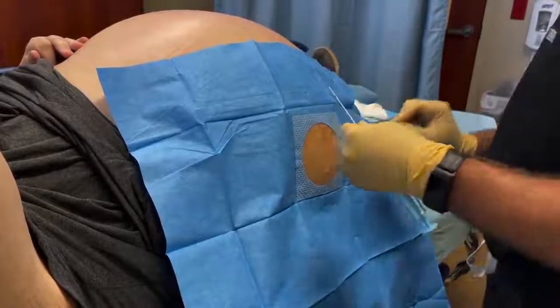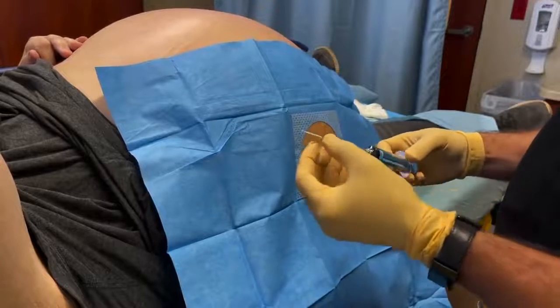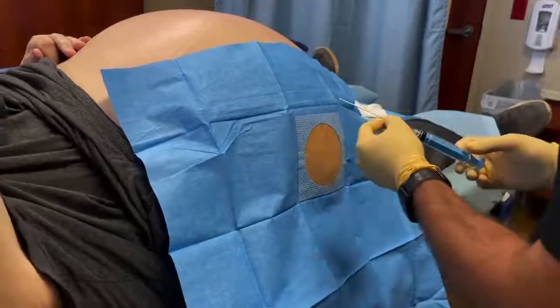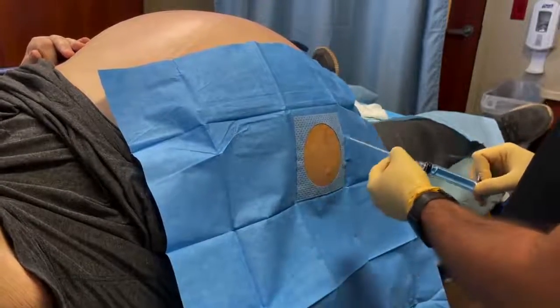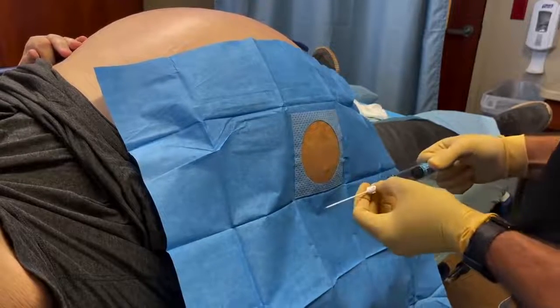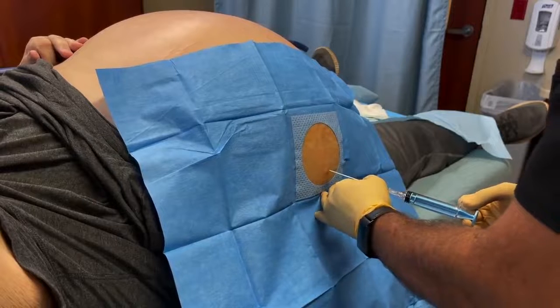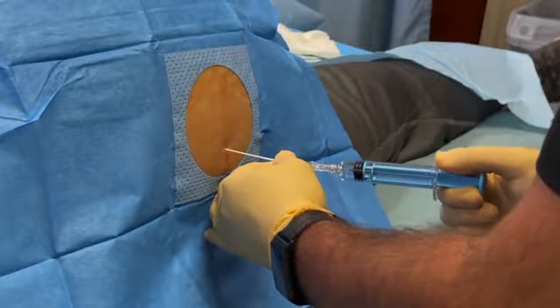And some people first nick the skin. I don't find that there's any need to do that. This is sharp enough to get through. As you enter the skin, you pull on the plunger until you get the fluid. And if you're doing it for diagnostic purposes, then you save the first amount for sending out to a lab. If you're doing it for therapeutic purposes like him, then you don't need to save it. So we go in, we start pulling back.